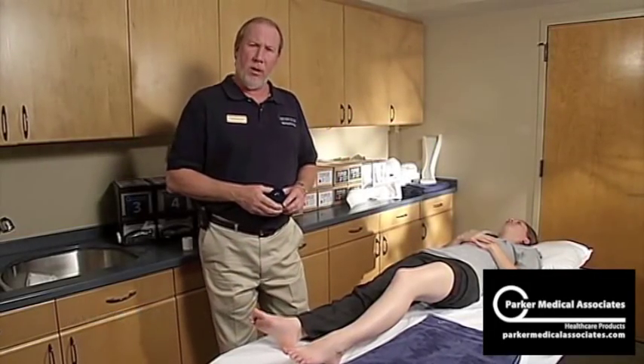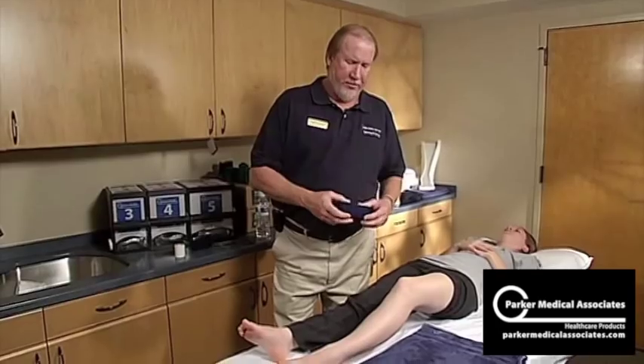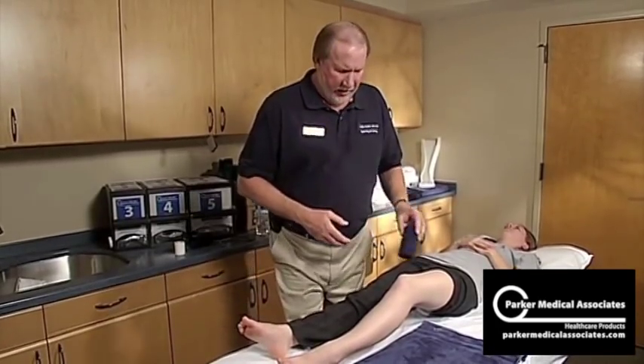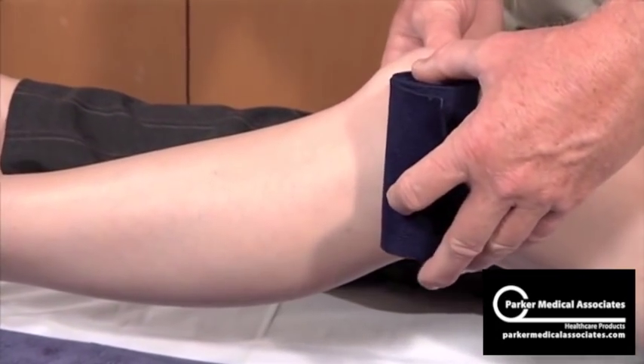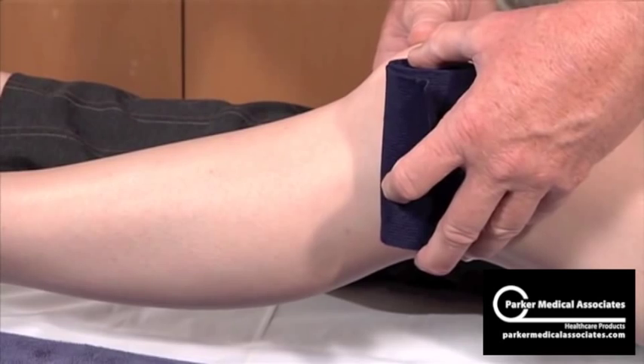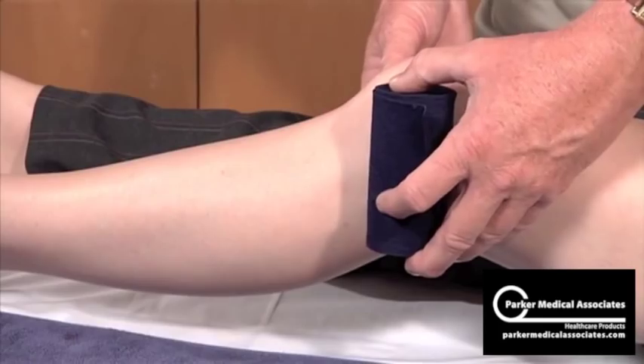I'm now going to demonstrate the knee immobilizer — how to determine your width. If you take a four-inch elastic bandage and come on the side here, and imagine another one on this side, as long as it doesn't overlap, that will be fine. So four would be fitting this leg just great.